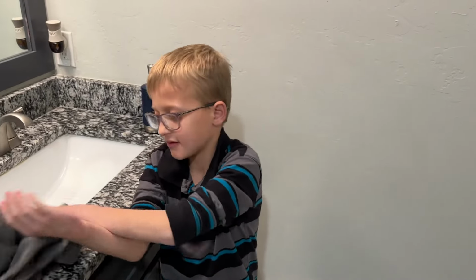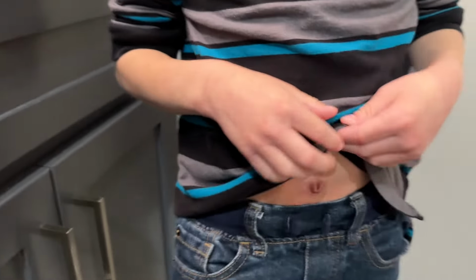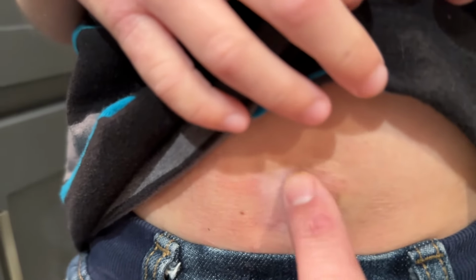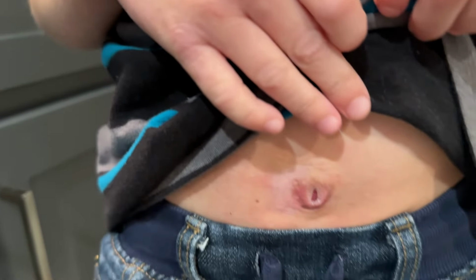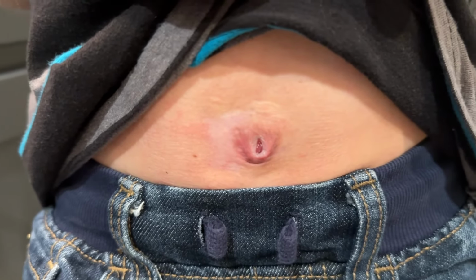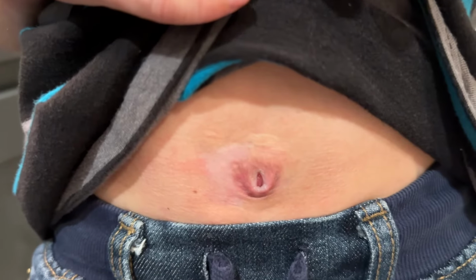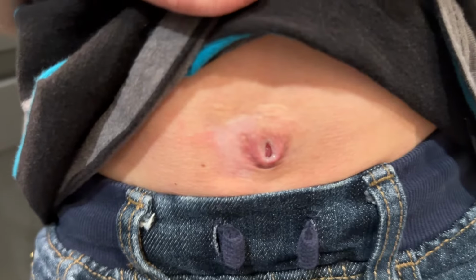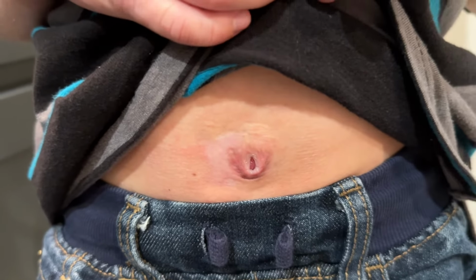So now that our hands are clean, and before we actually cath, let's take a look at your stoma really quick. So if we get in close here, we can see it's just this little hole right out of his belly button. Now it's fleshy, it's soft, I can touch it. You can see it doesn't hurt or anything. The other question people get is, will I be able to live a normal lifestyle? Austin is very active with mixed martial arts and karate and that sort of thing. He also loves to swim. He loves to ride ATVs, ride bikes, basketball, jump on a trampoline, all kinds of sports and things like that.